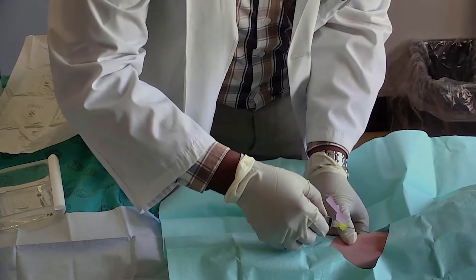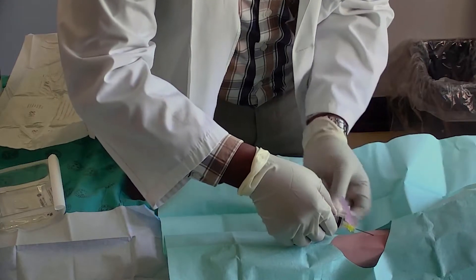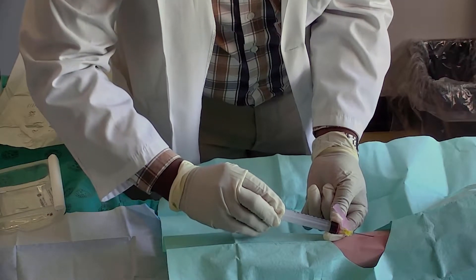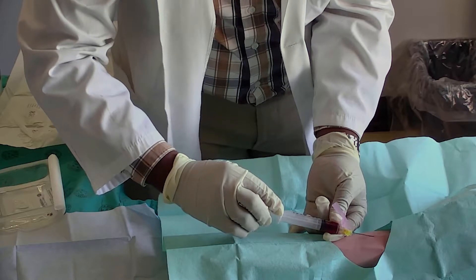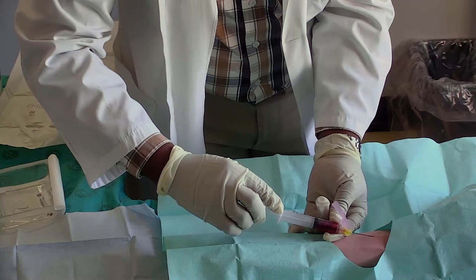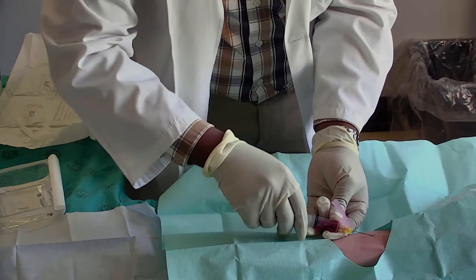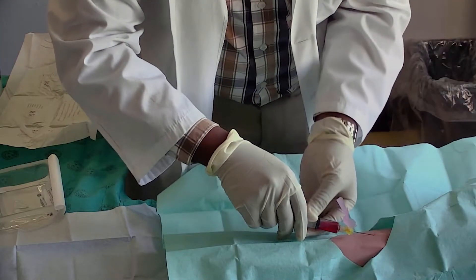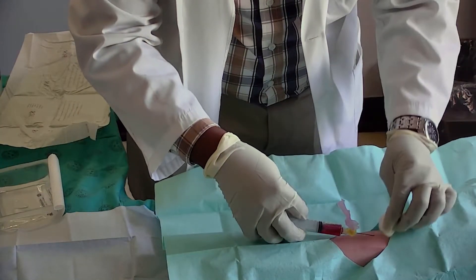With the bevel of the needle facing upwards, enter the vein swiftly at a 15 to 30 degree angle. Withdraw 10ml of blood slowly to avoid hemolysis. Release the tourniquet with one hand and withdraw the needle gently, applying pressure on the site with cotton wool. Ensure the needle does not come in contact with the cotton wool.